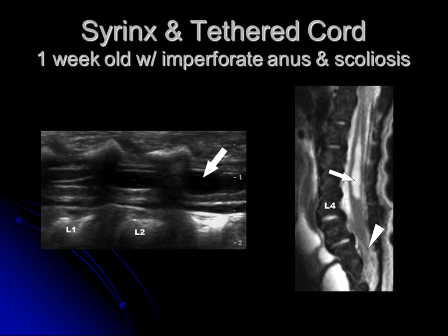This is a one-week-old with imperforate anus and scoliosis — again, a higher likelihood the test will be positive. This is a longitudinal ultrasound image of the spine at the levels of L1, L2, and the superior aspect of L3. You can see the spinal cord is in the spinal canal with distension of the central spinal canal that looks like a syrinx. This is confirmed on sagittal T2-weighted MRI of the lumbar spine, where the conus is really low — down at the S1-S2 disc space, marked by the arrowhead. The arrow points to the large syrinx in the distal spinal cord. This child has a tethered cord and syrinx.